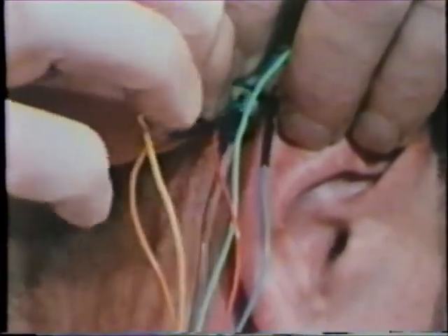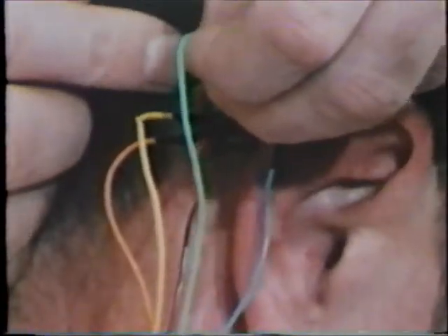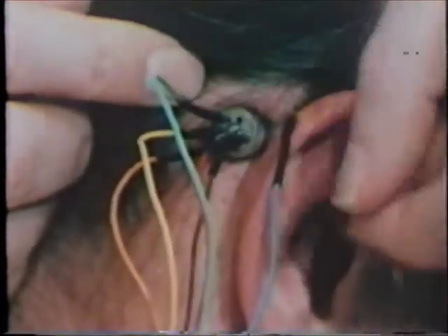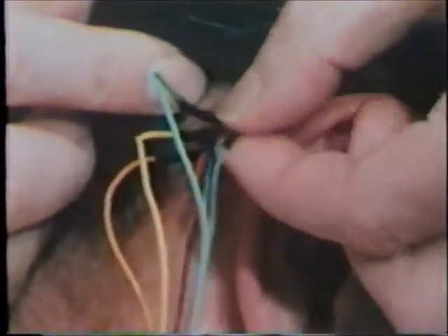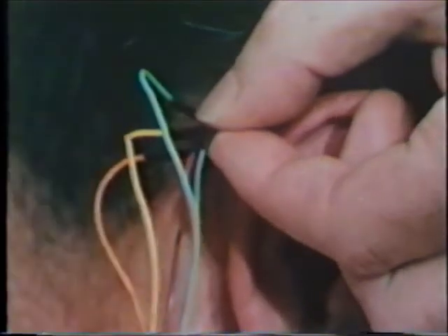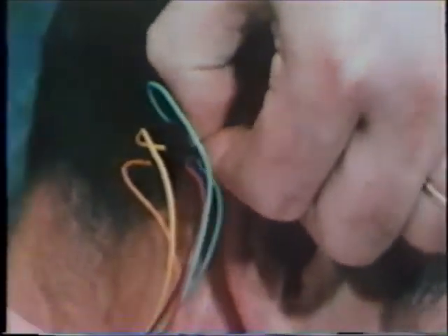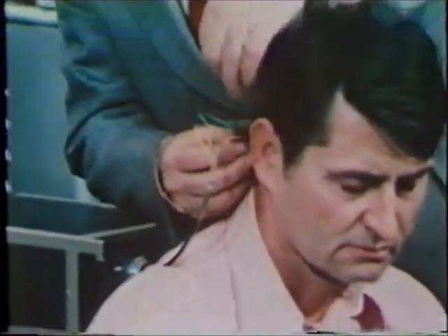We started with simple electronic waveforms and progressed over a period of 2 years to very complex electronic analogs of speech. We recognized that we would have to build waveform generators of increasing complexity as we gained more information. At all times, the safety of the patient was paramount.